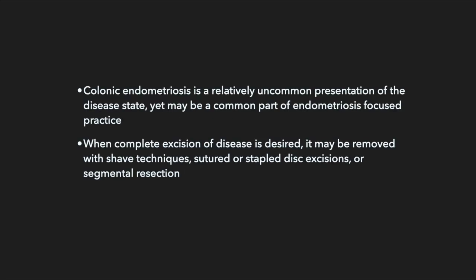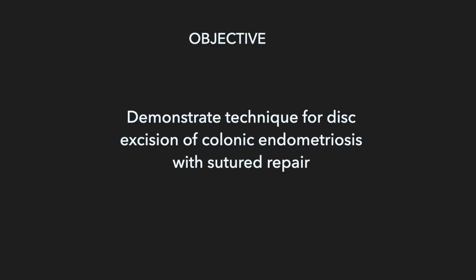Colonic endometriosis is a relatively uncommon presentation of a disease state, yet may be a common part of endometriosis-focused practices. When complete excision of disease is desired, it may be removed with shave techniques, sutured or stapled disc excisions, or by segmental resection. While the case this video comes from was complex and had many elements, the purpose of this video is to demonstrate technique for disc excision of colonic endometriosis with sutured repair.